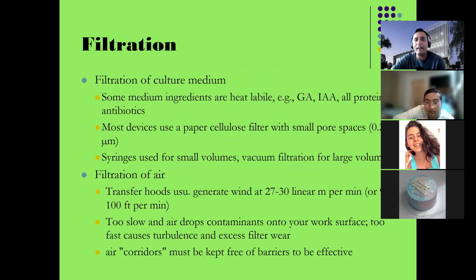I already mentioned filtration. So the filtration: what you filter and how you filter. We have paper filters normally in a tissue culture lab. Whatman is a very famous company that produces the world's best filter paper, and they have dozens of patents in that area. They create different kinds of papers, using suction with a flask. You can put them between the flasks.